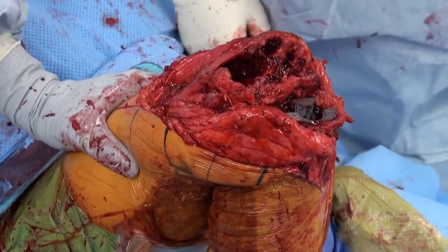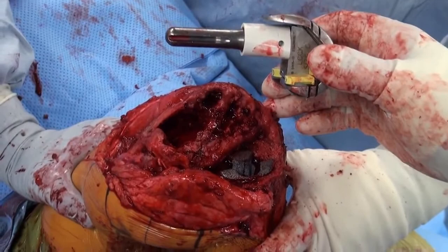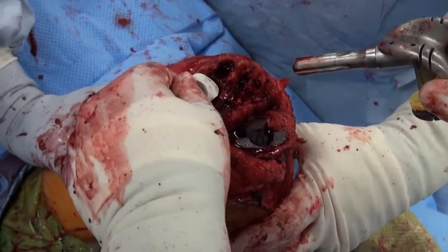A choice must be made between available cones when additional fixation is required. This shows the trial for a diaphyseal cone, available more recently for use with smaller defects. This provides added fixation, but no rotational control for the femoral component, as shown here.